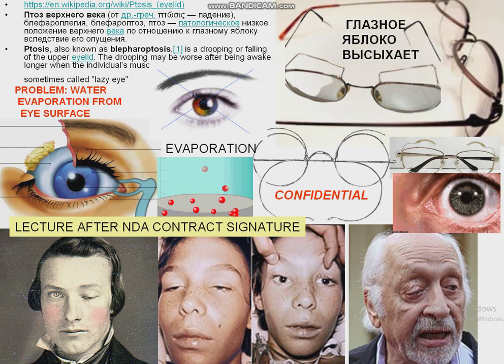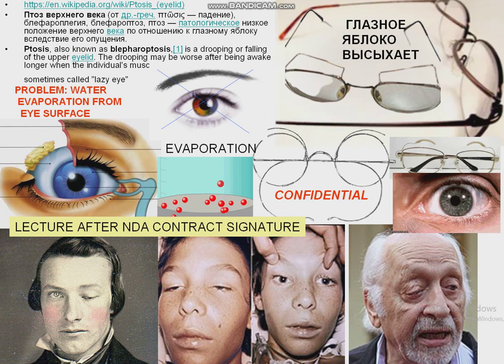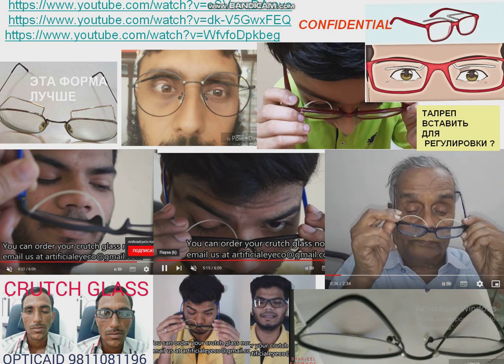The main problem in ptosis is the application of mechanical devices. These mechanical devices cause drying of the eye because of evaporation. It is necessary to create a new version of the machine, and you can consider several existing prototypes created in 1973. How they work, and you will obtain an obligatory conclusion.